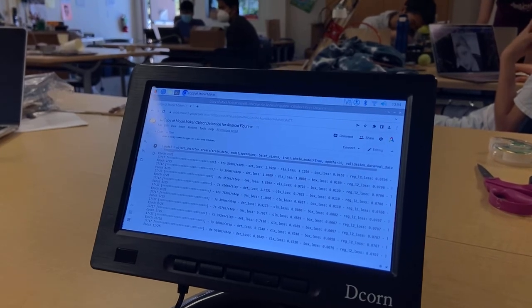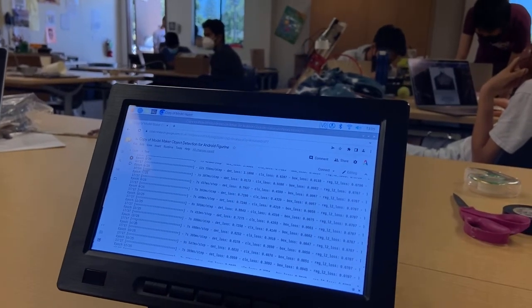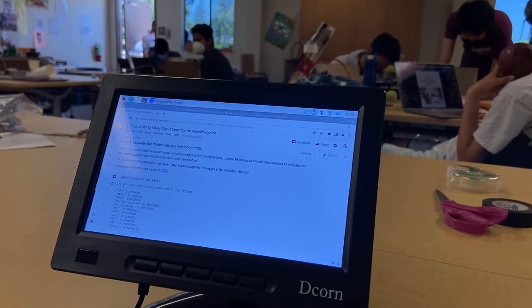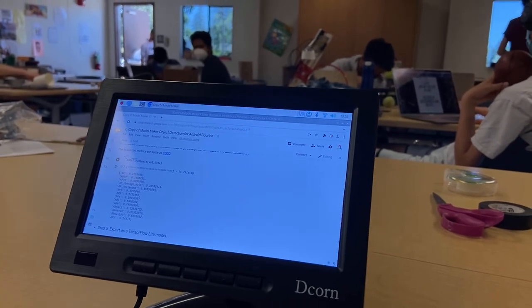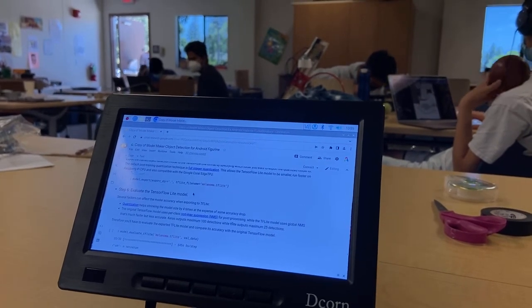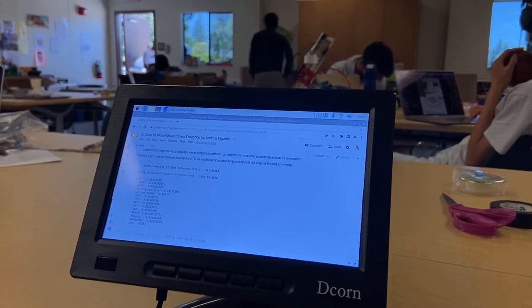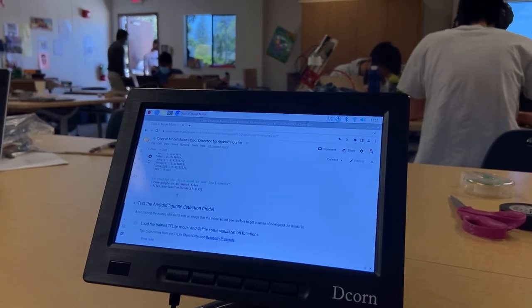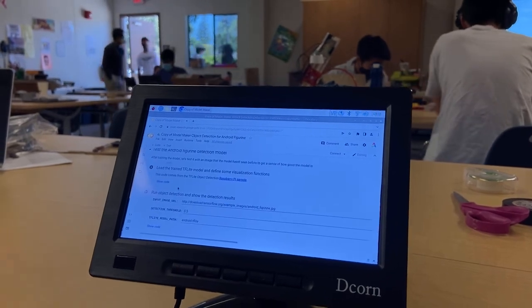So as you can see, the loss rates of each epoch are printed, and it goes through 25 epochs, each of which has 17 steps. This is how the model gets evaluated, and there are different precision rates depending on how you view them. This exports the model to the directory over here, and this evaluates the quantized version, so that's why it's in general less accurate. Now the TF Lite file gets downloaded to Raspberry Pi, and that's it.